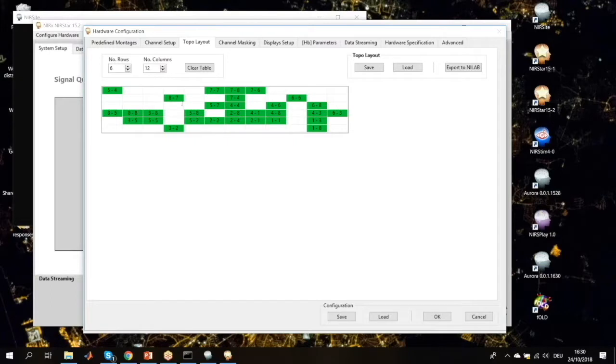As you can see here, I have source 1, detector 8. I have one channel. Source 2, detector 8, I have my second short channel. Similarly, source 3, detector 8 is my third short detector channel, up to source 8, detector 8. So when we run the calibration, we should see all these channels.